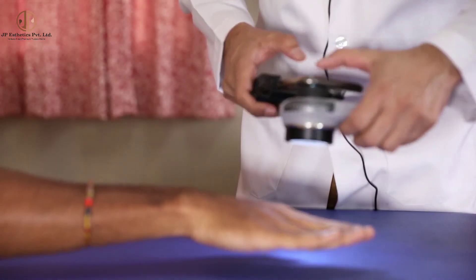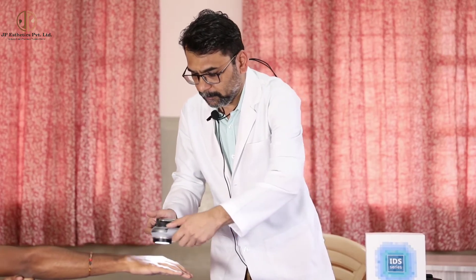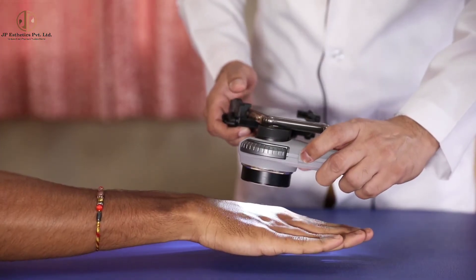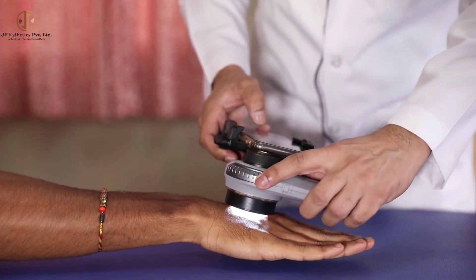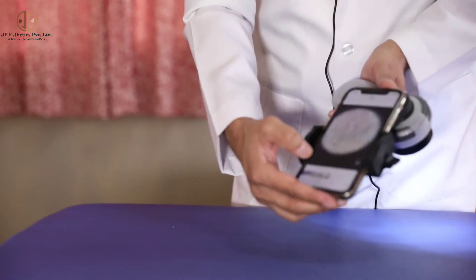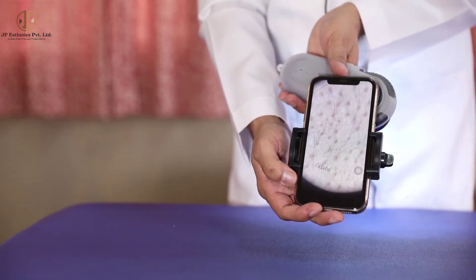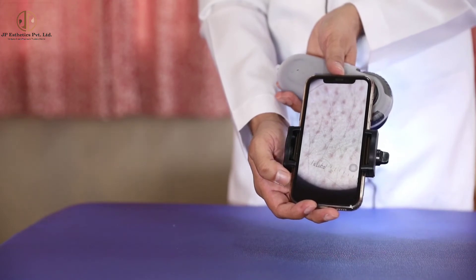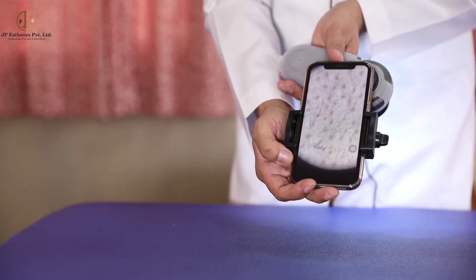Now I will take a polarized mode image. Always try to adjust this rotator so that the image should be clear. This is a polarized mode — it will show us the pigment network and deeper structures in the skin.